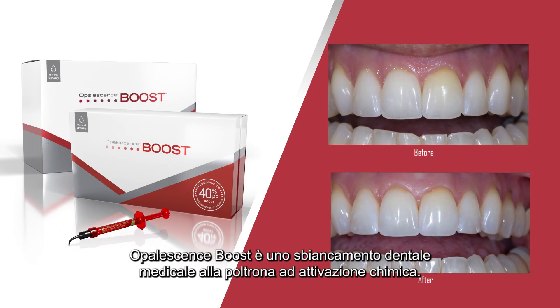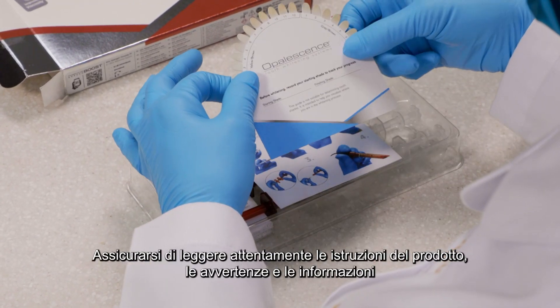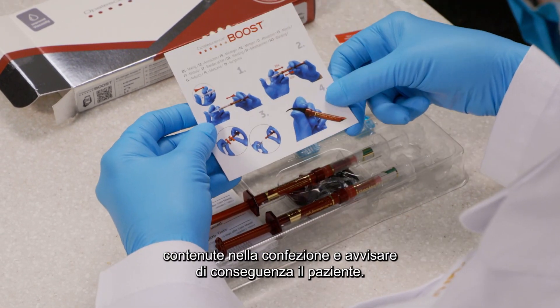Opalescence Boost is a chemically activated in-office tooth whitening treatment. Be certain to read the product instructions, warnings, and information for the patient contained in the package and advise the patient accordingly.